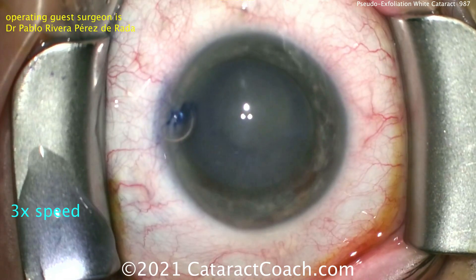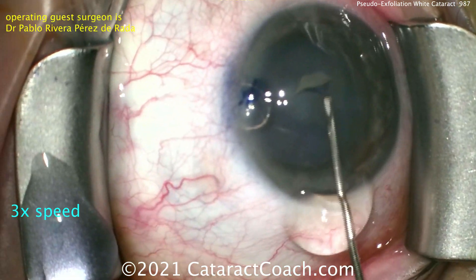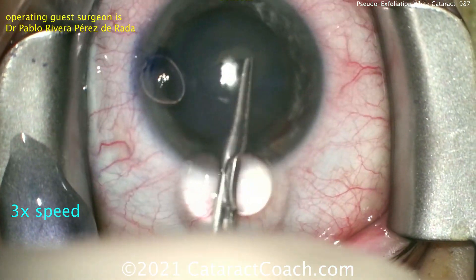The capsule has been stained with TriPan Blue dye, there's the main incision, and time for the capsulorhexis. Now in this case, it was noted to be a white cataract, but not intumescent, so you notice there's no milky, liquefied cortex coming out of the capsular bag.